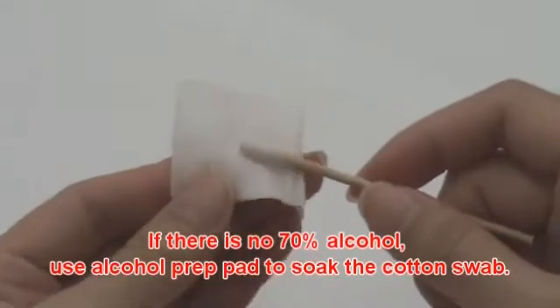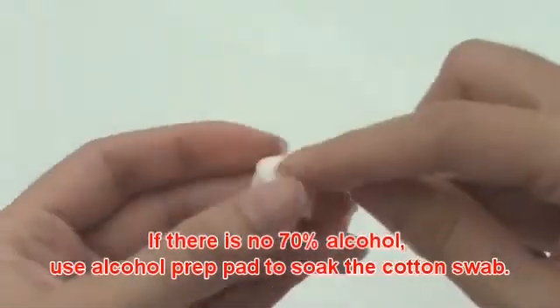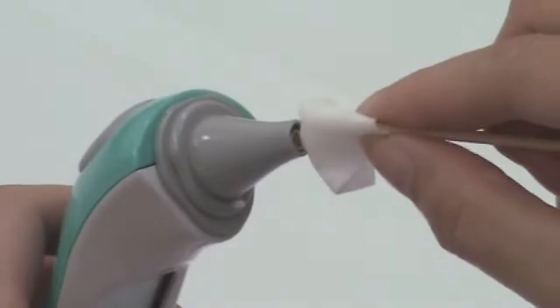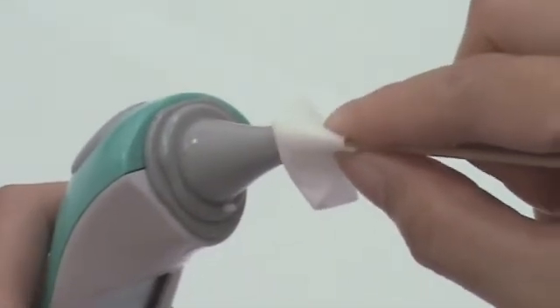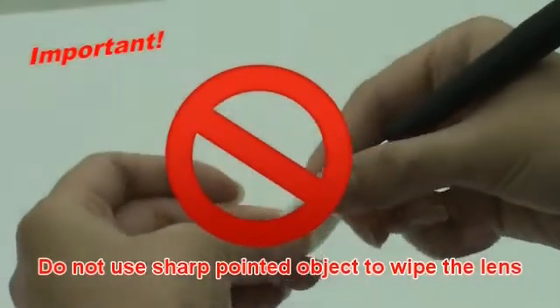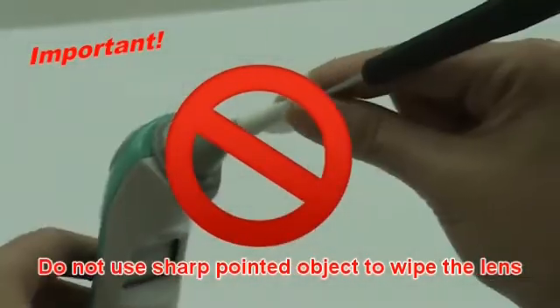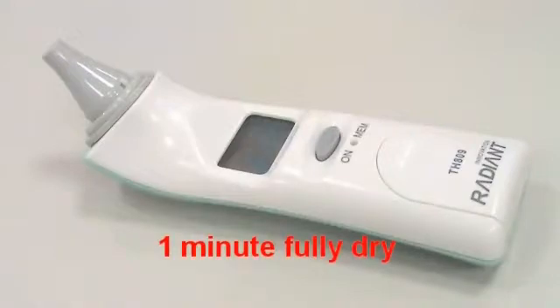If there is no 70% alcohol, use an alcohol prep pad to soak the cotton swab. Do not use a sharp pointed object to wipe the lens. Allow the probe to fully dry for at least one minute.